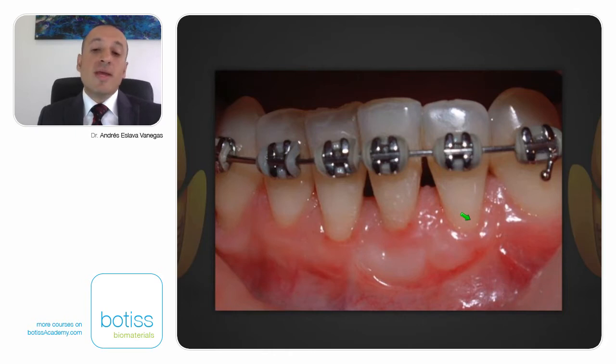You can see here, 1 year after we did the surgery, a root cover of like 100%, even better than the other side, but the color match is not as good as we want it to be. You can see the scars here. You can see the deviation of the mucogingival junction. The primary thing we wanted to do here was a root covering procedure and to increase the keratinized tissue, but the aesthetic is not so good.